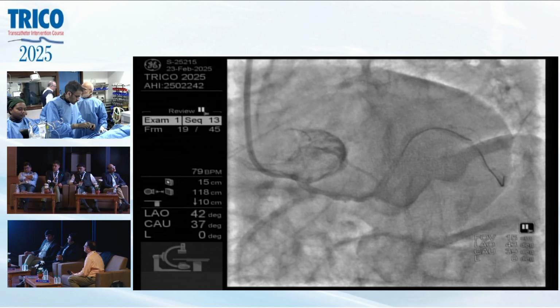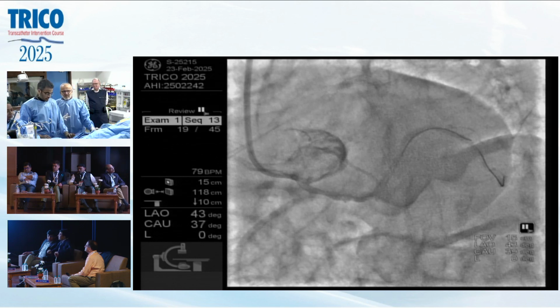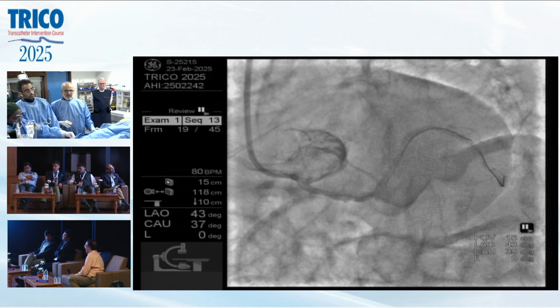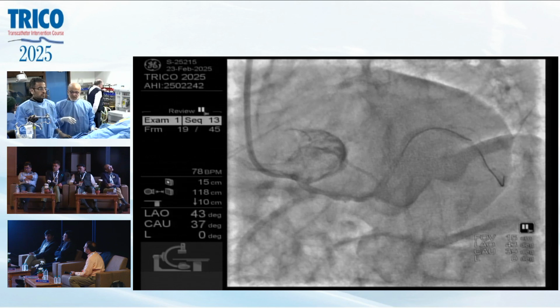In that case, we can do OCT in that region. That should not be a problem, and we will show whether we have landed in it. See, OCT imaging, it's very clear. Again, Dr. Akasaka's seminal study: landing, proximal distal landing. If it happens in a normal segment, by and large, restenosis never develops in that region. A 744 patient study done in Japan, and he has evaluated proximal distal landing with OCT.